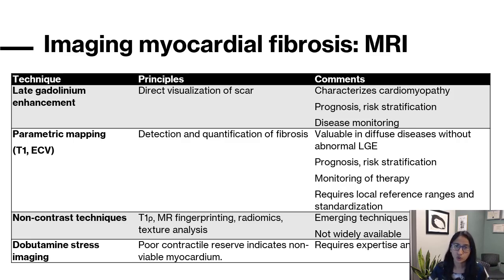Dobutamine stress imaging is used for viability assessment. However, this requires a lot of expertise.